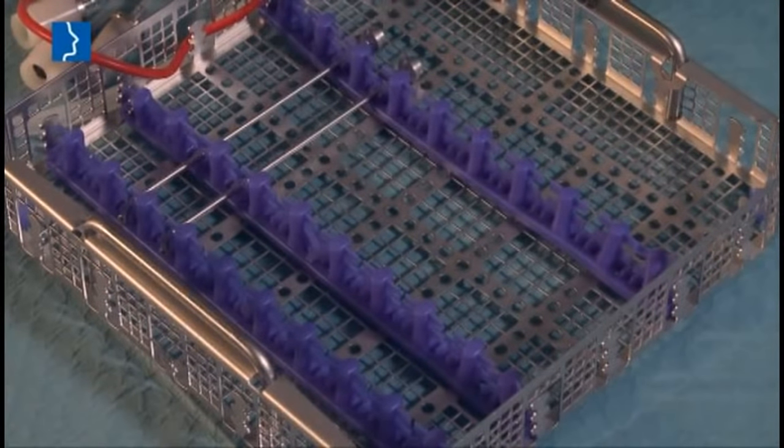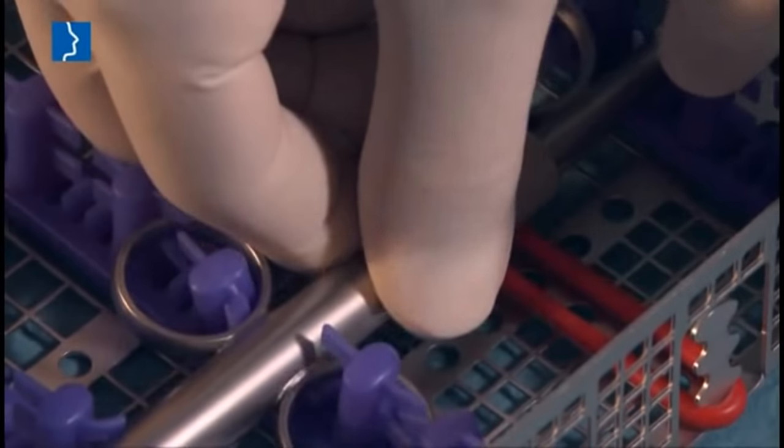After use, the instruments are cleaned in a validated way using the cleaning and sterilization basket.